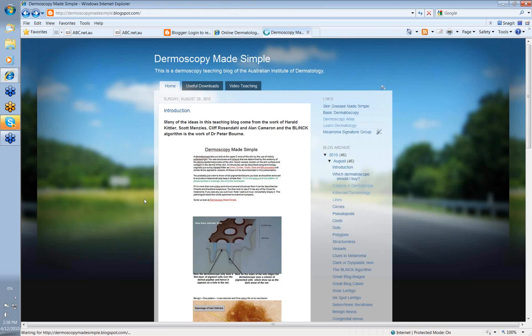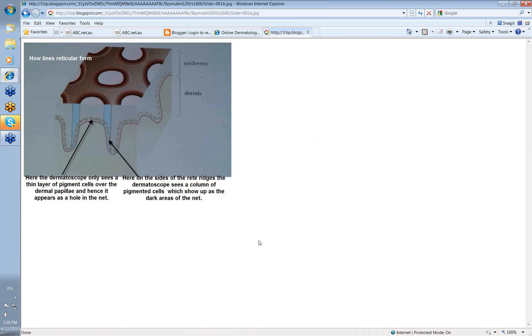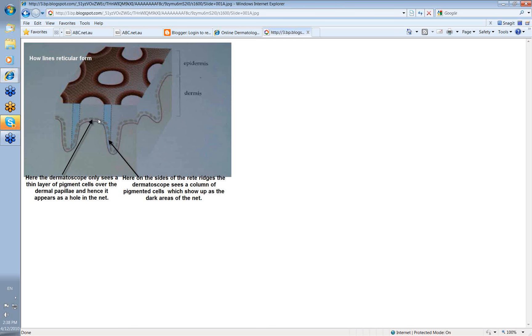So let's look back at the dermoscopy made simple. This slide shows you how lines reticular form. Now, lines reticular is the net-like structure that you see when you look at most benign nevi. As you can see here, you've got holes and then you've got the darker area of the net. Now the holes correspond just to this thin layer of melanocytes or melanin just over the tops of the dermal papillae.